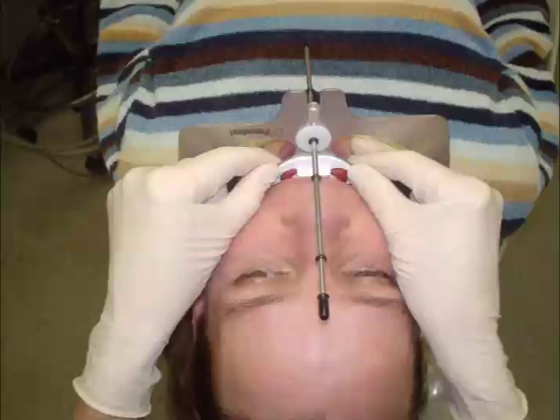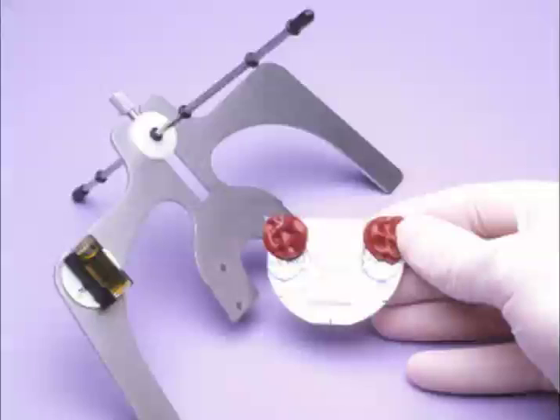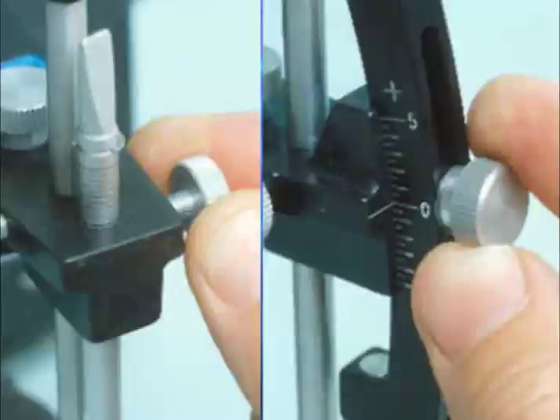We can do this in the supine position so we can really focus on the vertical rod, which is the critical aspect of this system. If you get a 1/2 degree cant in the vertical rod, you're more than likely to get a 1/2 degree cant in your dental midline and your final prostheses. So now we capture the cants and tilts of the occlusal plane in the bite registration material on a horizontally aligned index tray. We can now come to the articulator where we set the incisal pin to 0.